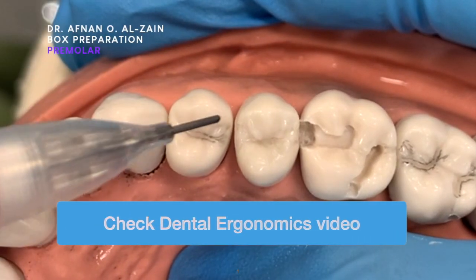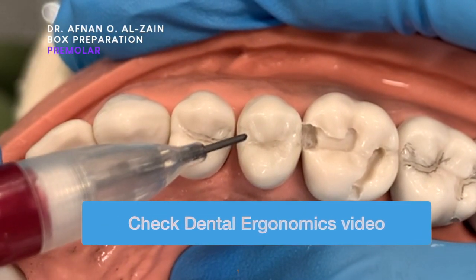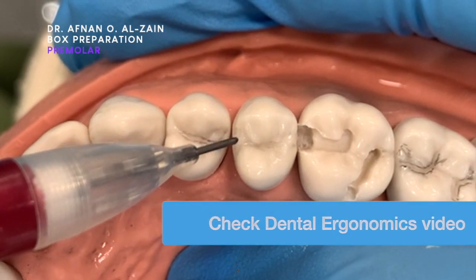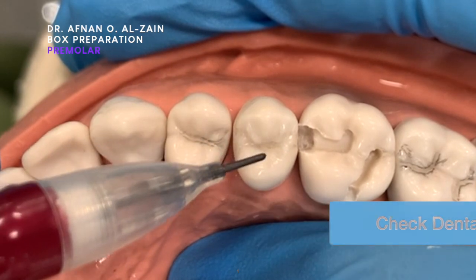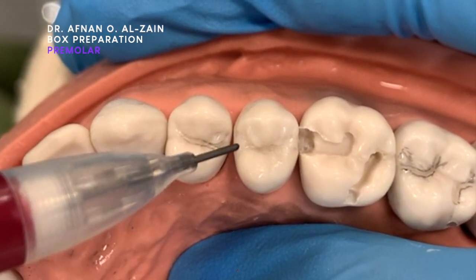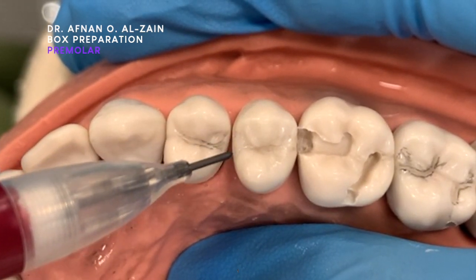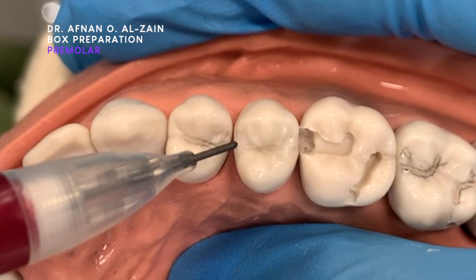So we have to choose number 5. The box preparation is basically where you do not include an occlusal part, but we will do a box here in the proximal lesion.